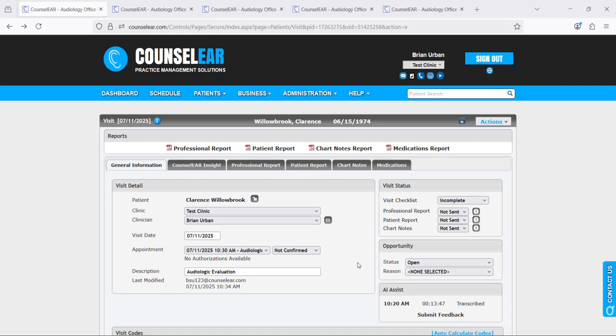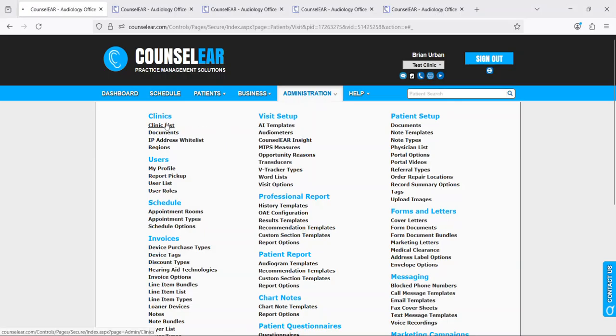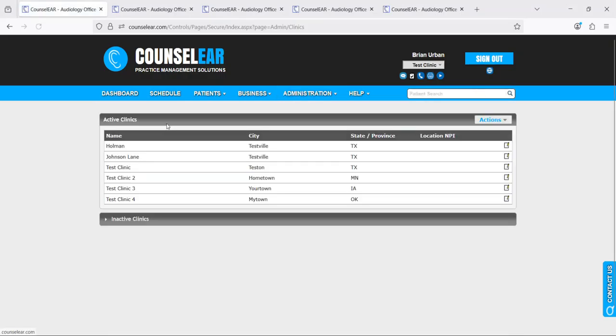So let's begin by showing how you activate the AI Assist feature. We'll begin by clicking under administration in the top menu bar and then we'll select clinic list.